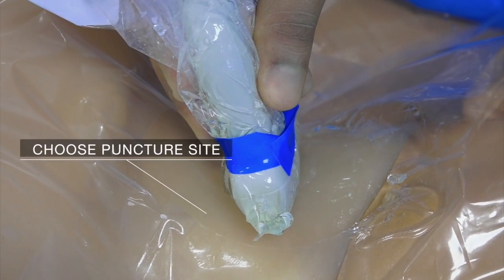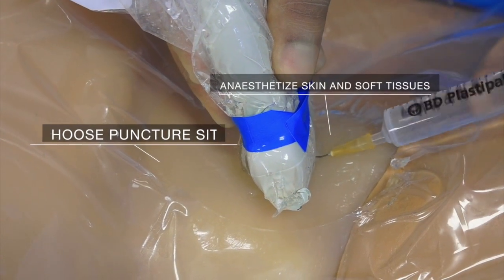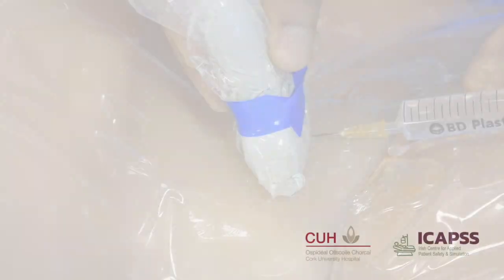Choose a puncture site by looking again with the ultrasound probe. Anesthetize the overlying skin with local anesthetic. This may not be necessary if the patient is sedated and on an opioid infusion. We will now discuss three techniques for accessing the right internal jugular vein.